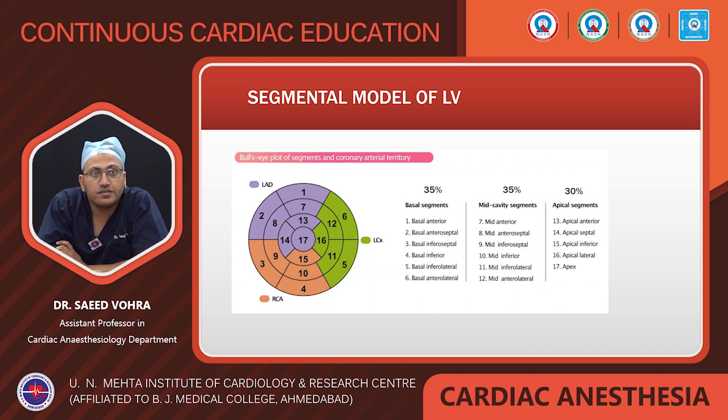Then inside the outer basal segments, there are the mid cavity segments, which, going clockwise, are mid anterior, then mid anterolateral, then mid inferolateral, mid inferior. Then there is a mid inferoseptal, then there is a mid anteroseptal.